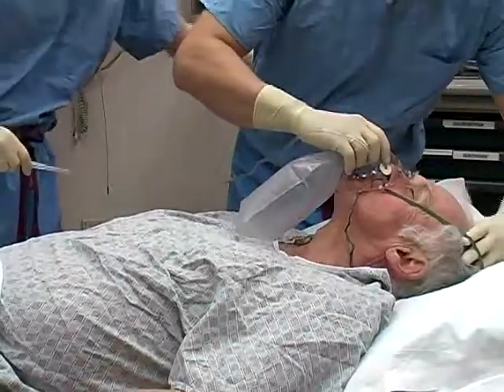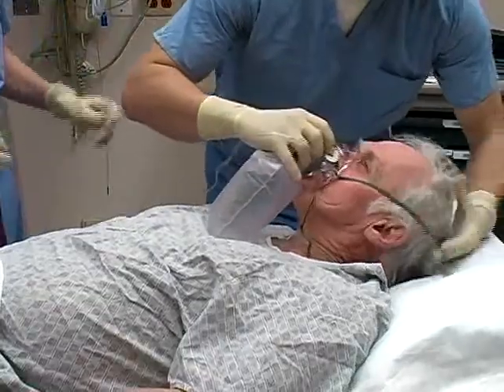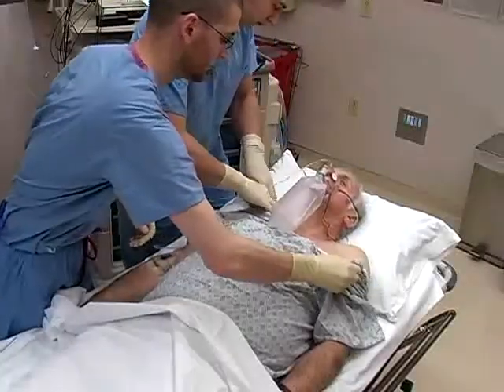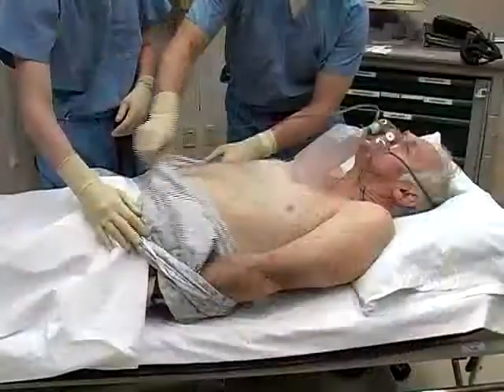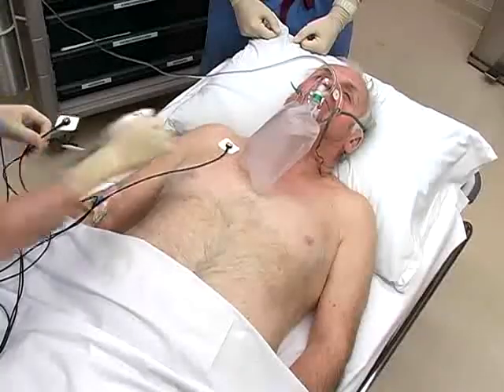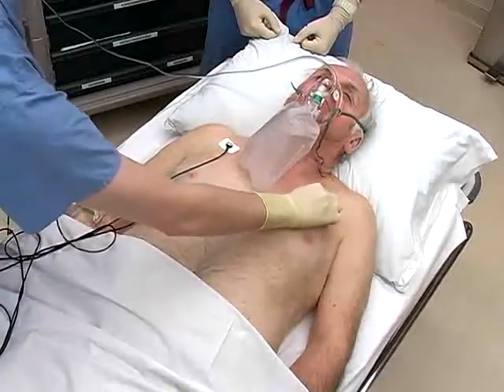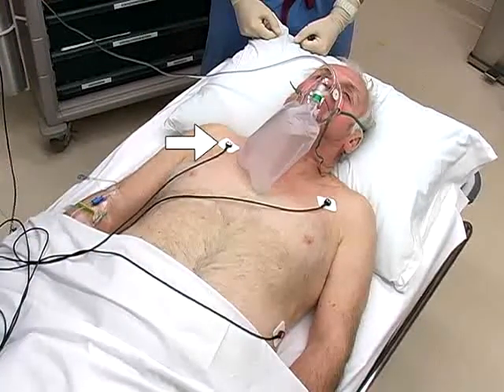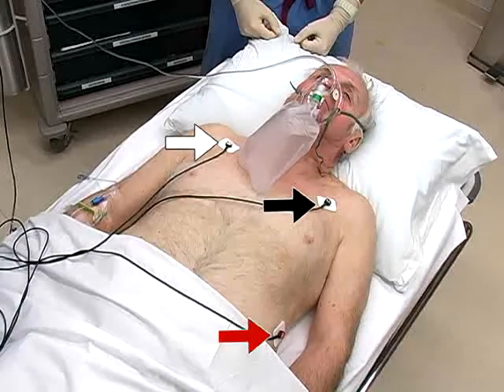Prior to cardioversion, place the patient on oxygen and establish an intravenous line. Expose the patient's chest so that the monitor leads and defibrillation pads may be easily attached. First, place the monitor leads on the patient. The white electrode is placed on the right chest, just below the clavicle. The black electrode is placed on the left chest, and the red electrode is placed on the left chest at the anterior axillary line just below the left breast.